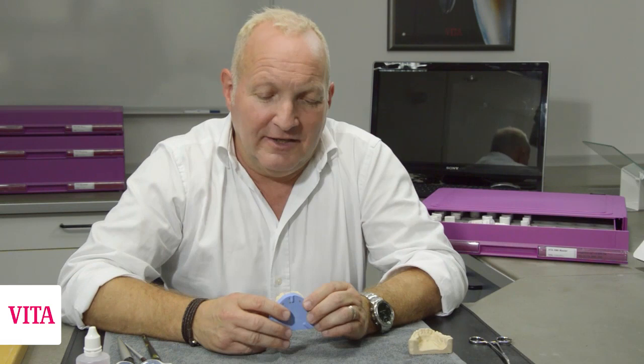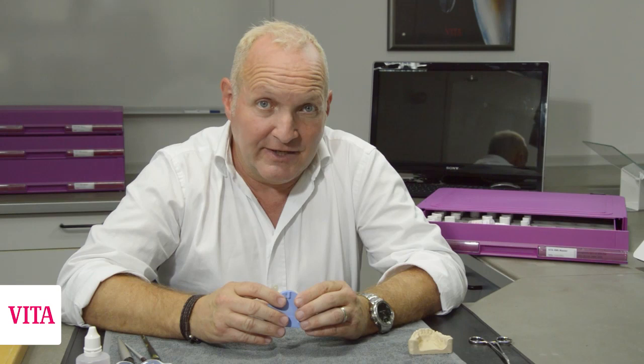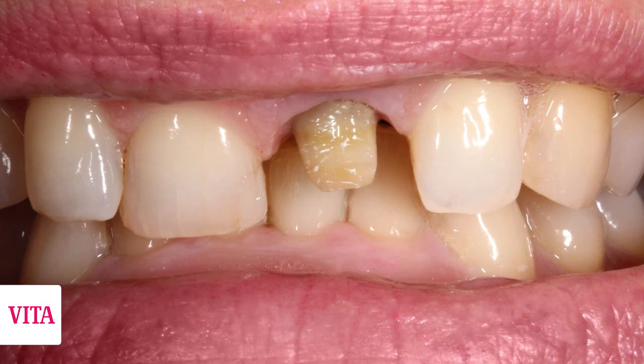Our case study today is tooth 2-1 in incisal, with less space for layering. We chose ceramic because we have a discolored tooth, and for this case it is mostly better to use metal ceramic instead of full ceramic because you get better coverage of the discoloration. We use our CAD CAM system to build up the metal coping, then start layering with VMK Master to get the most perfect aesthetic result.